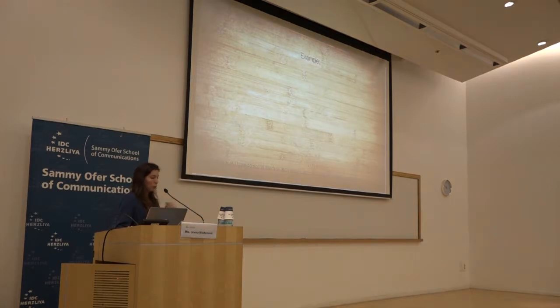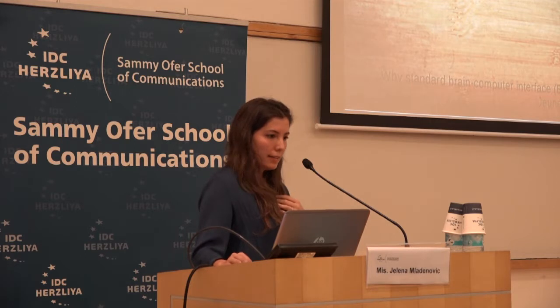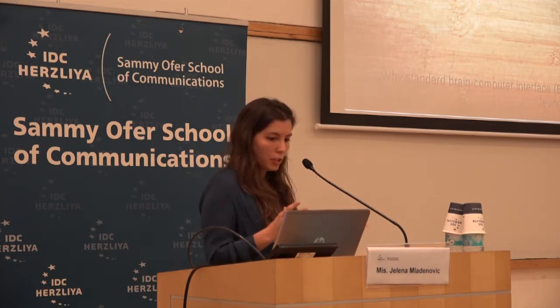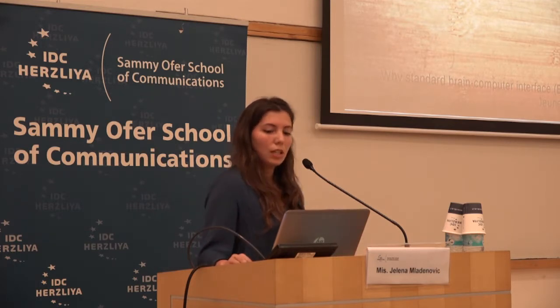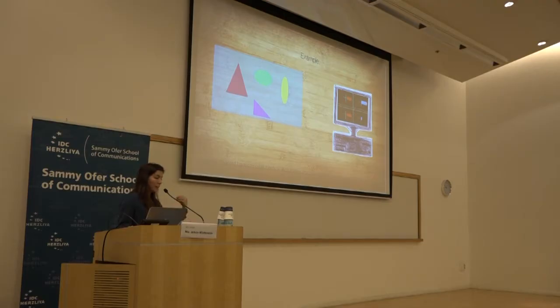So I want to give you an example of a study showing how important the feedback can be. The participants had to draw triangles or ellipses on a pad, and they didn't know the correct form, size, or position of these objects. As guidance they used the typical BCI feedback and instructions used for motor imagery, that you already saw in previous presentations.